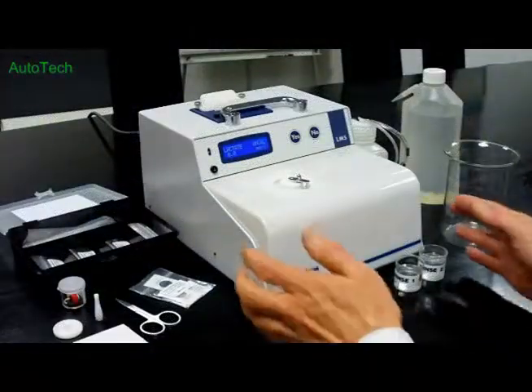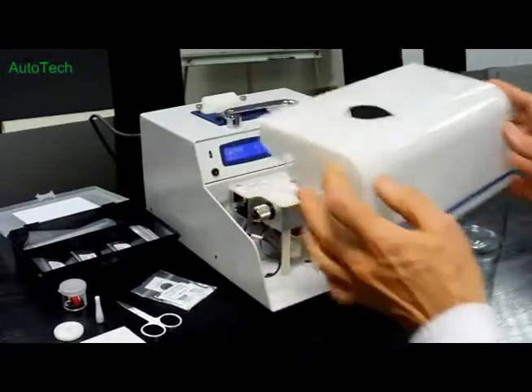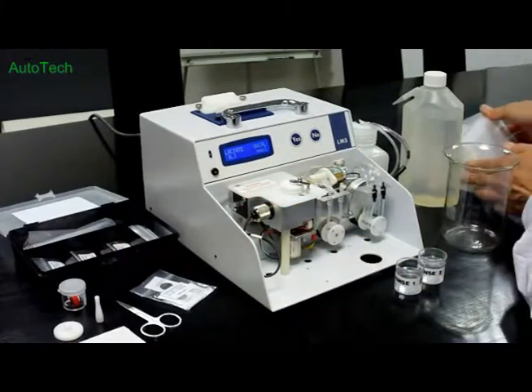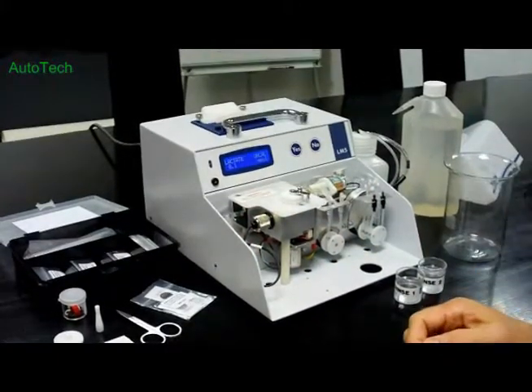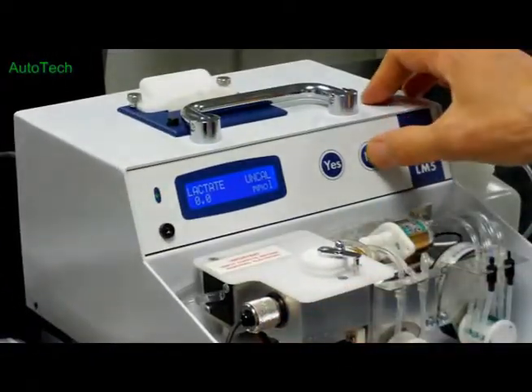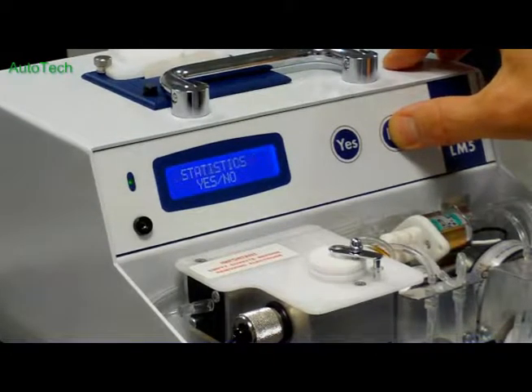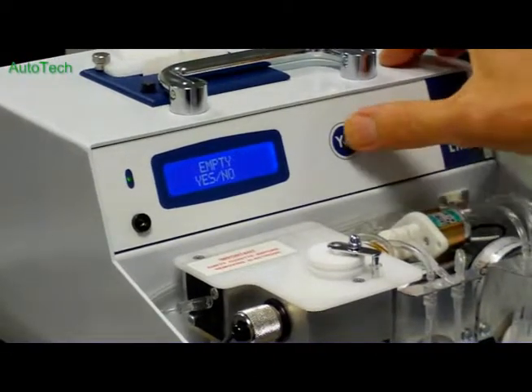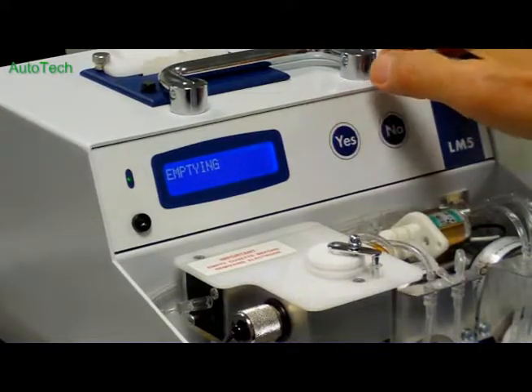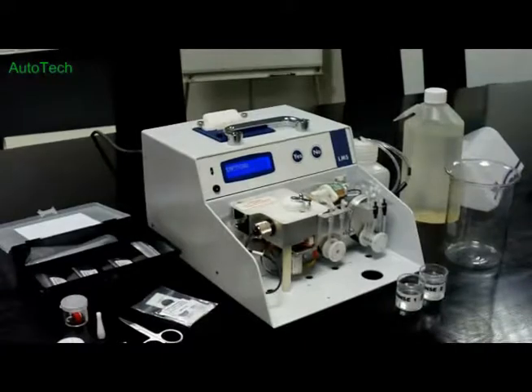So we're going to remembrane the electrode, and we start by removing the dust cover. And then it's most important that you empty the reaction chamber before removing the electrode. So go through the menu until you come to empty. Say yes. This empties the reaction chamber.